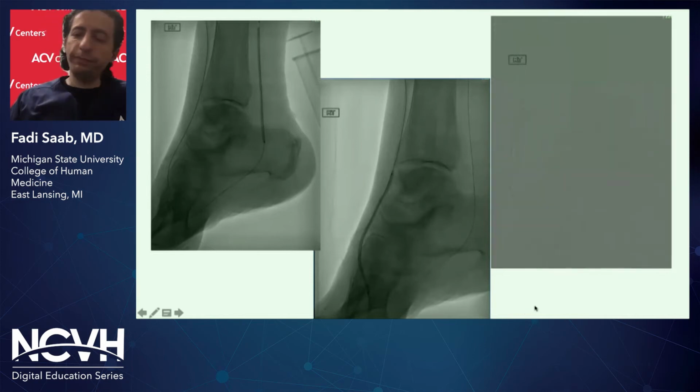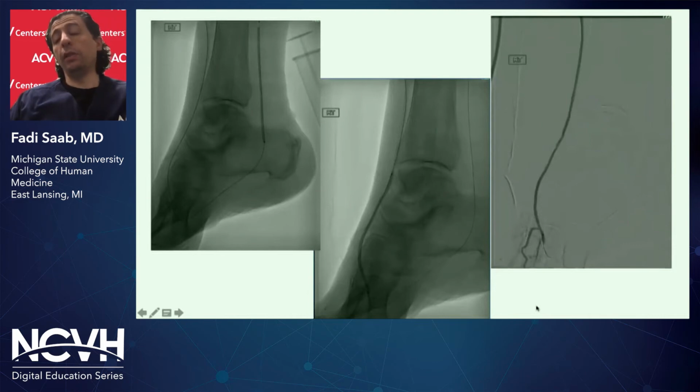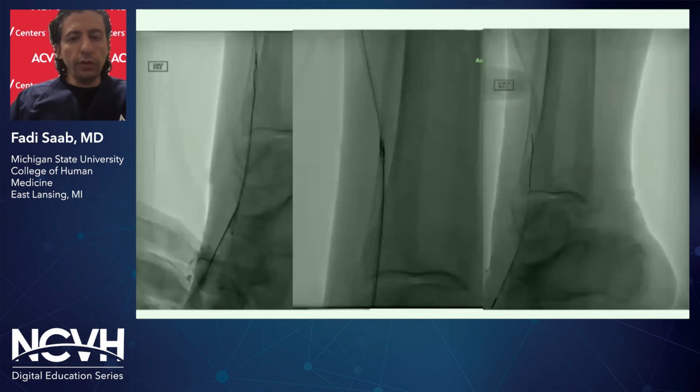Now remember, we still need to treat the SFA, the popliteal, and the proximal tibials are still occluded. So what do we do here? So let me walk you through this again.